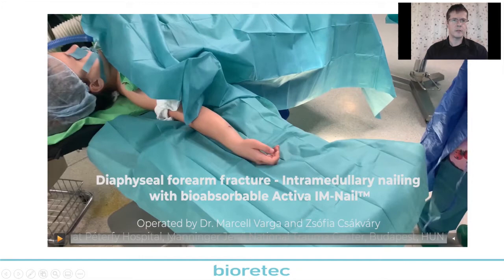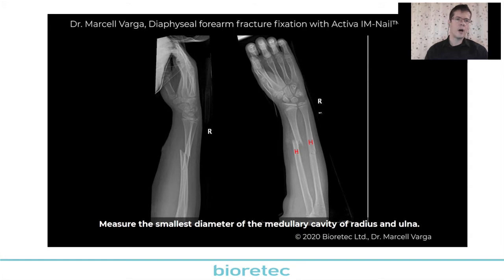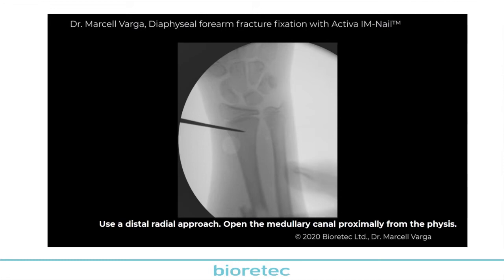Yes, here we can see our surgical technique. It is almost the same. The patient is in a supine position. The arm is on a radiolucent table. Here we can see an unstable fracture, very unstable, in a little girl. And we do the steps of the operation under fluoroscopy. Here we can see the radial entry nailing.